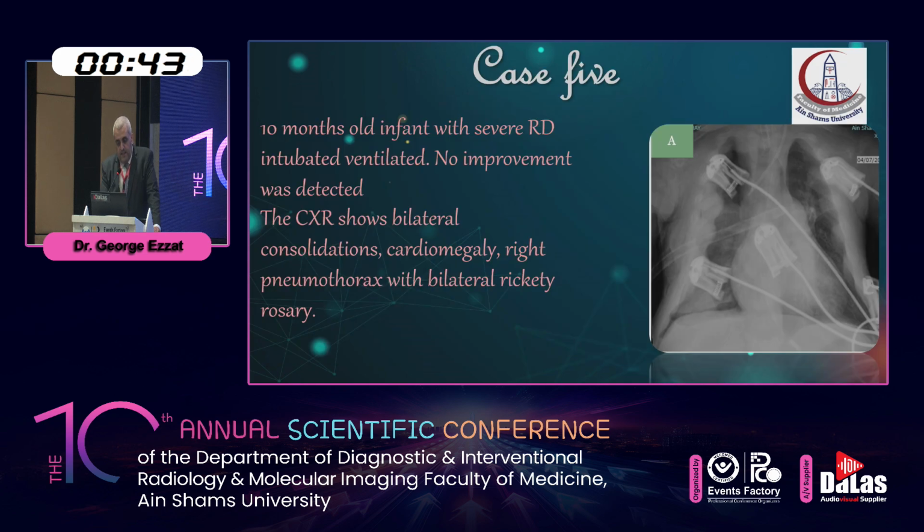In case 5, this is a 10-month-old infant with severe respiratory distress and with no improvement after intubation. Chest X-ray shows bilateral consolidations and right-sided pneumothorax. I don't know if you can pick it up from here. There's right pneumothorax and bilateral rickety rosary.